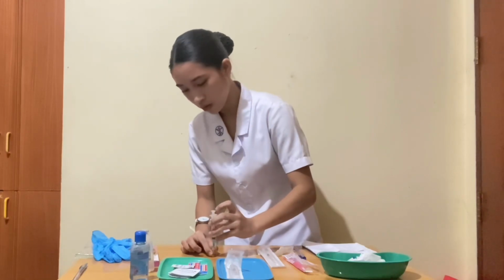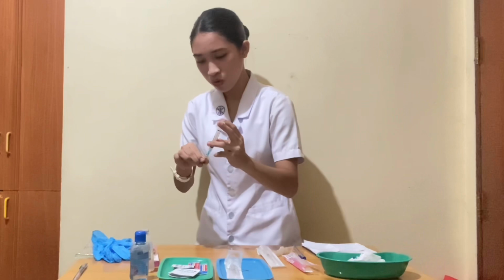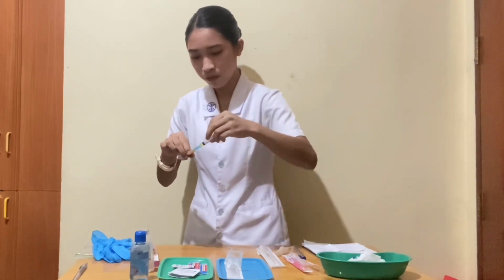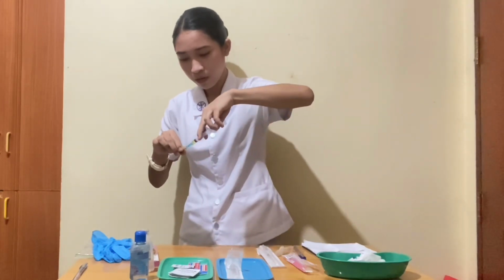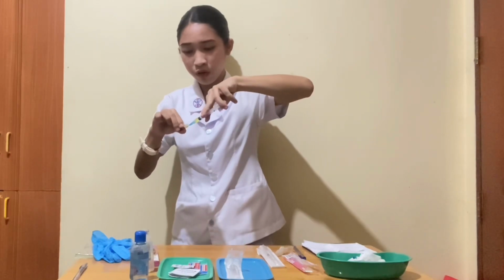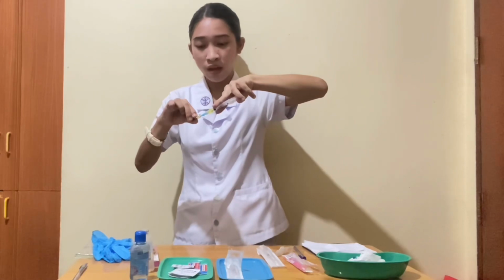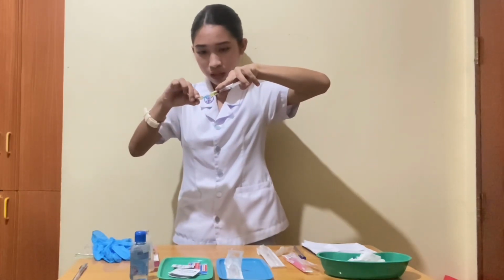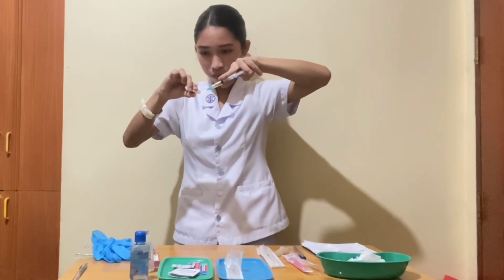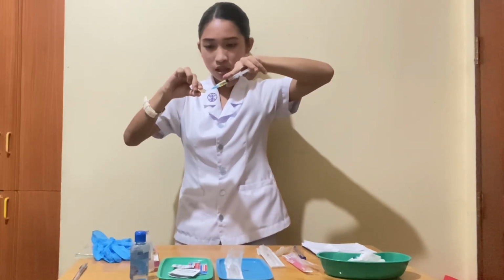Now I'm going to withdraw an exact amount. Since it is easy for me to get the medication, we make sure to keep the bevel down to get all the medication, and then do it like this to get all of it, because this was taught by my last clinical instructor.